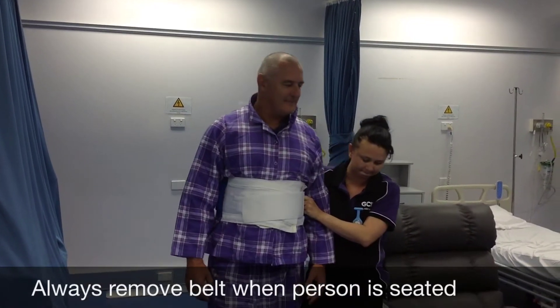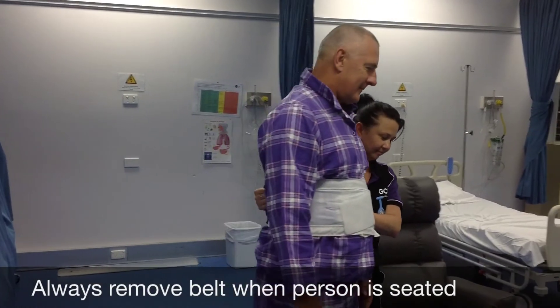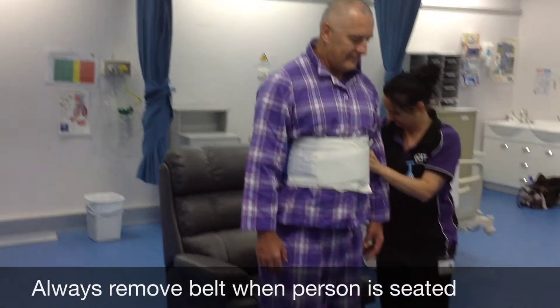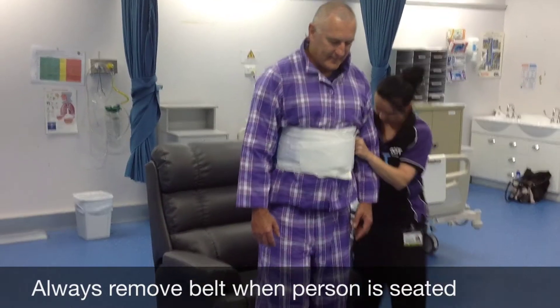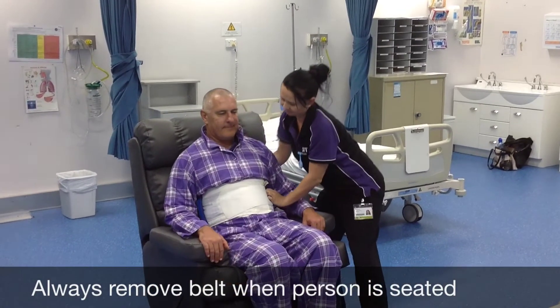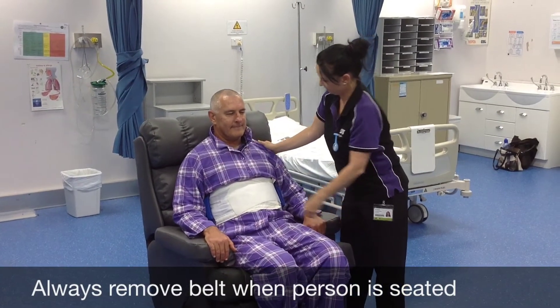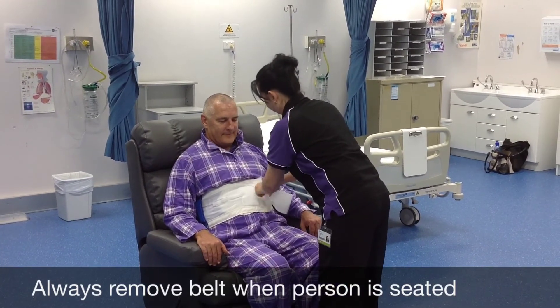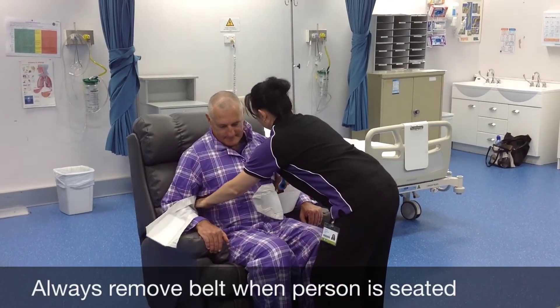When it comes time to sit somebody in a chair, get them to feel the chair behind their knees. They should reach out for the arms and then ask them to bend their knees and sit down. Once they're seated in the chair, always remove the belt — it would be very uncomfortable to try and eat a meal if you had that walk belt around your tummy.